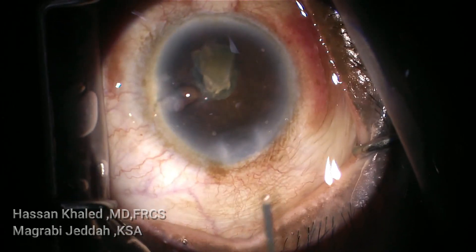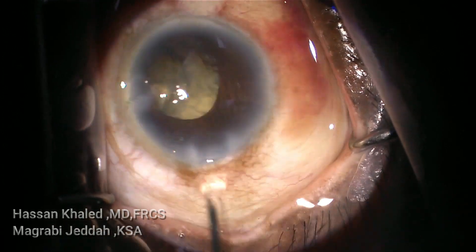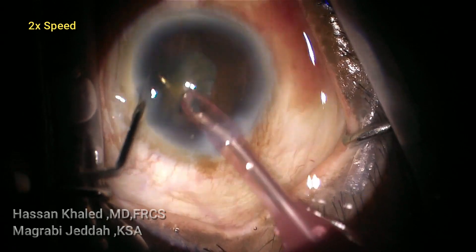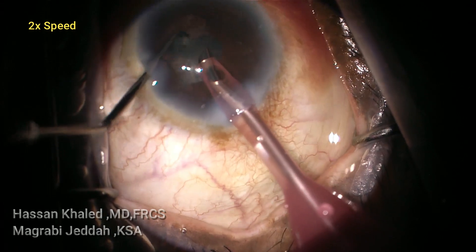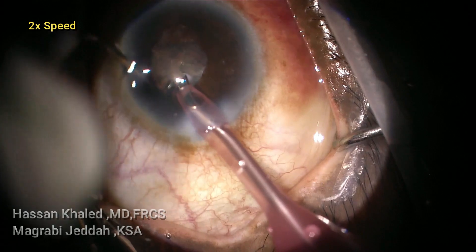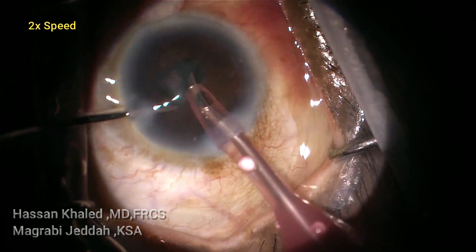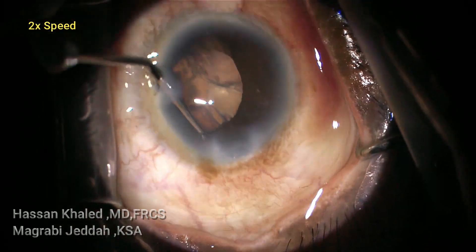I think it would have been better to use pupil expander devices while emulsifying this dense cataract. But actually the pupil was very well dilated at the beginning of the surgery — more than 6 millimeters in diameter. Again you can see the pupil is about 2 millimeters. Now you can see the last piece, and also the epinucleus and cortical shell by the end of the surgery.